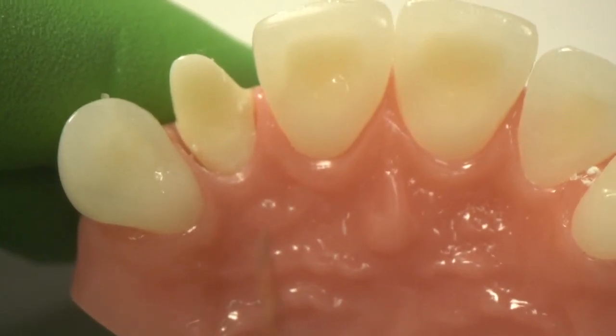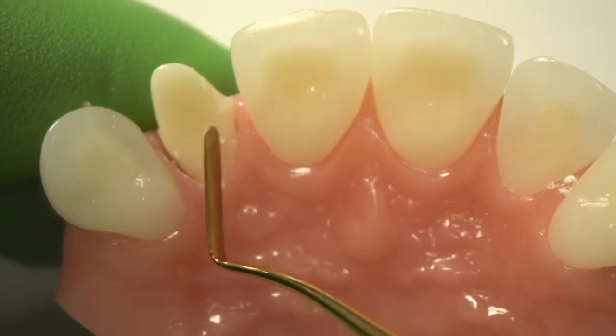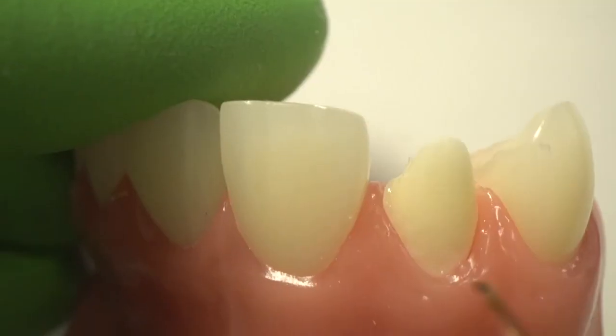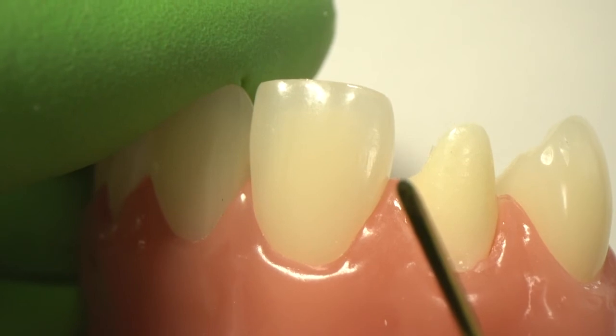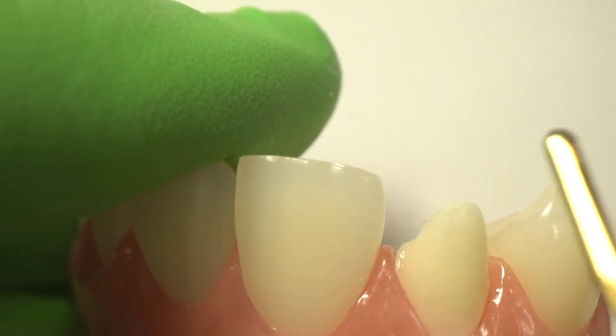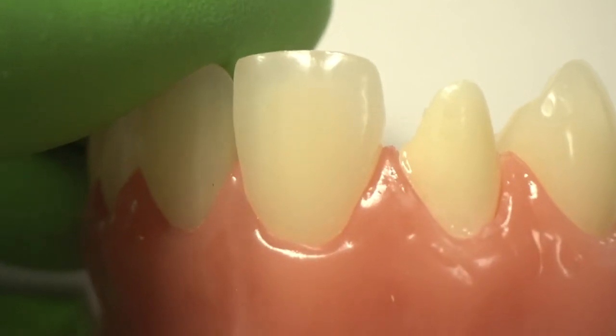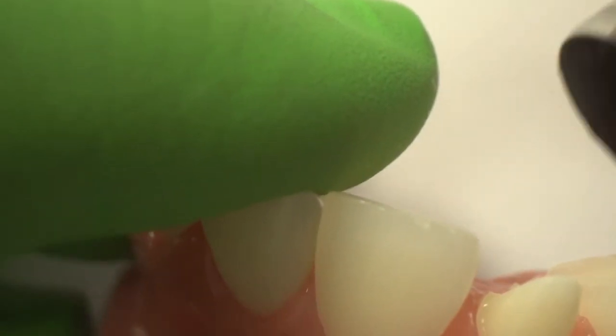Come in with your IPC or thin instrument and blend along the lingual. I'm coming back to the facial. Now we can see how the cervical margin is at about the height of the papilla, which is what I'm looking for — because now I can freehand the rest of the composite. Let's cure from the lingual and from the facial to make sure that the composite is completely hardened.